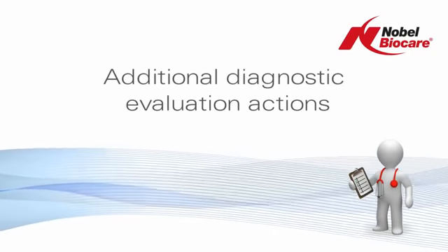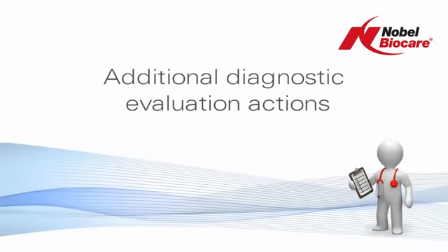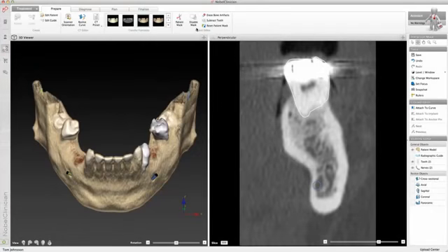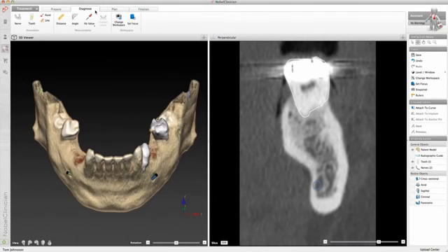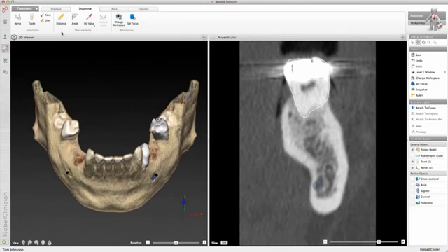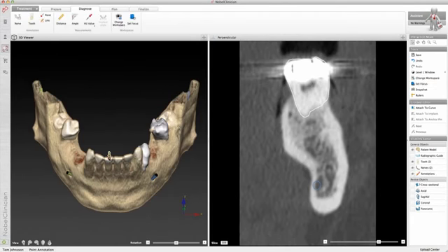Additional diagnostic evaluation actions are available. To annotate a nerve or a tooth, specific diagnostic functionalities are available. To annotate other anatomical structures, points or lines can be used. Select the point icon at the top of the screen, and then click in either a 3D or 2D scene to show a point with an arrow.